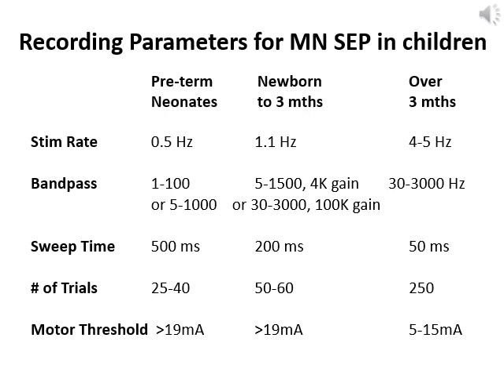The band passes are also different in the children versus the adults. In the children over 3 months, it's getting close to what is used in the adults. But in the younger children, the band pass is lower. So the low frequency filter and the high frequency filter both are lower. As well, the gain is higher in the young children.